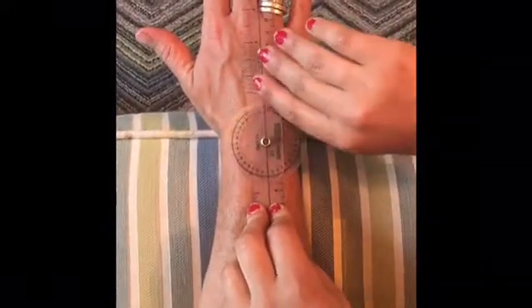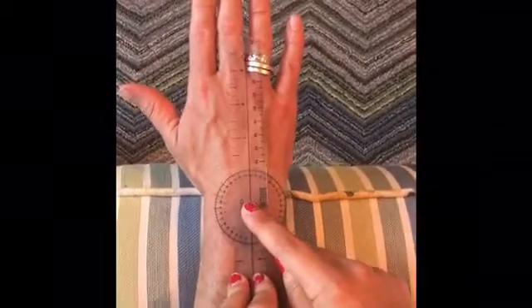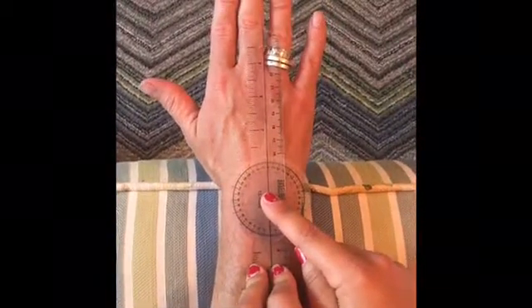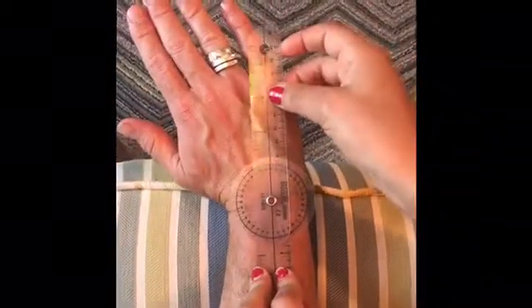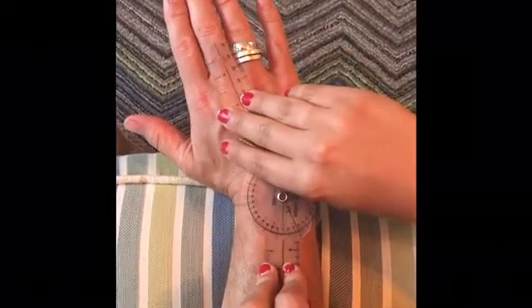Okay, we're going to be measuring wrist radial deviation. The typical range of motion is 0 to 20, sorry. The axis is going to be the base of the third metacarpal over the capitate. The stable arm is going to be midline of the forearm, and the moving arm is midline of the third metacarpal. So go ahead and deviate radially. And it is at 25.